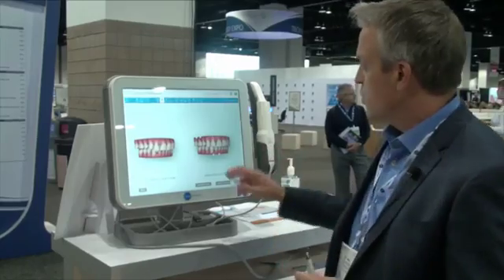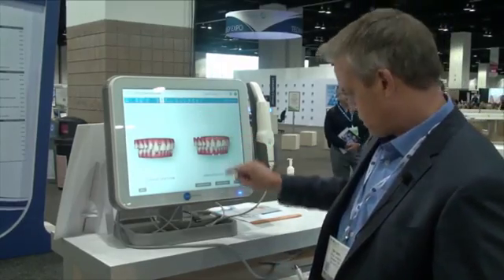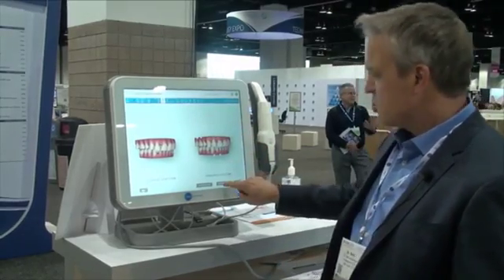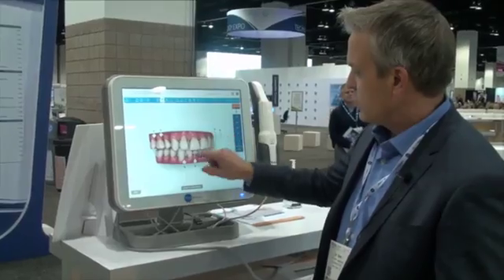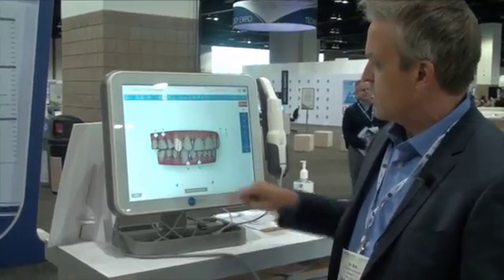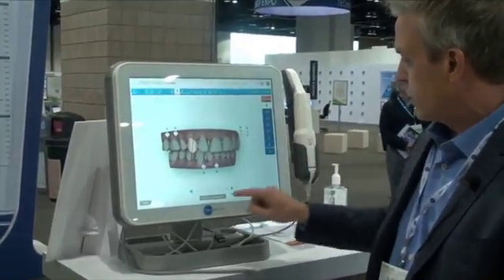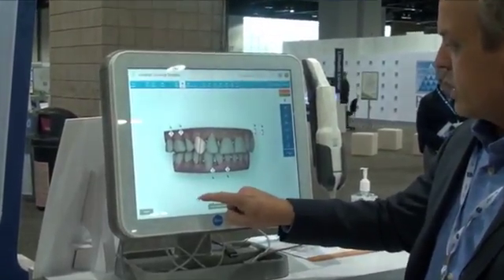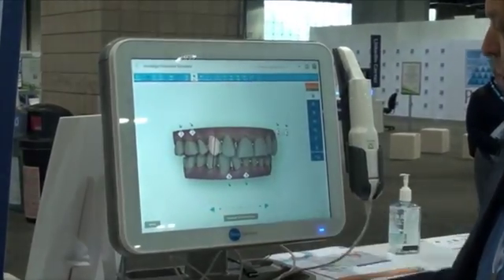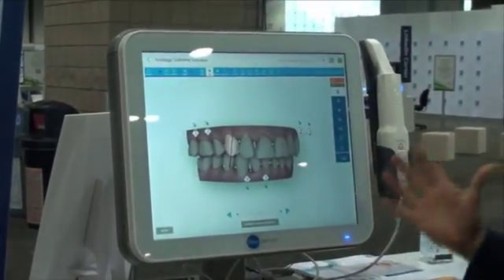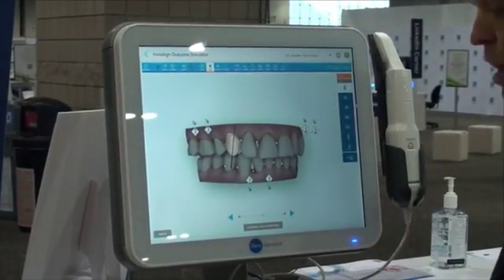It's easy to do. Basically what you're going to do is hit 'Adjust Outcome' and you're going to highlight the tooth that you want to adjust. Say you want to take this canine and you want to intrude it a little bit — you're going to hit the arrow key here and intrude the tooth. And then you can give that simulation a little tweak if you will.